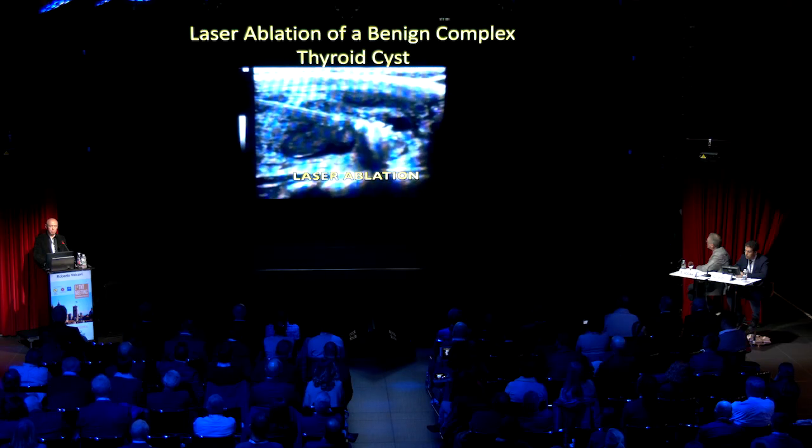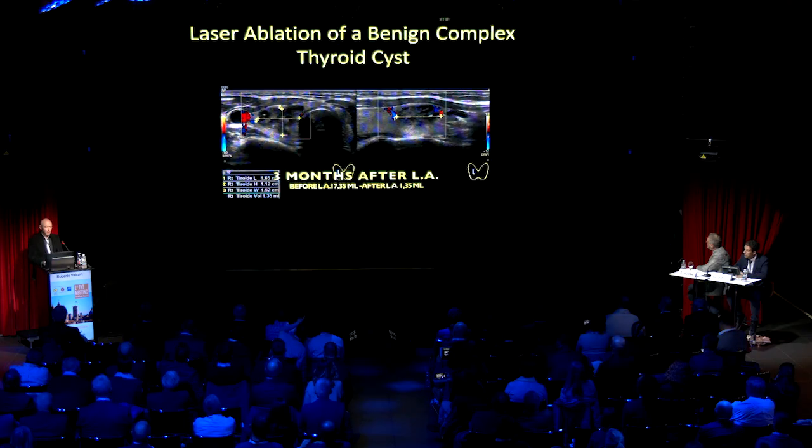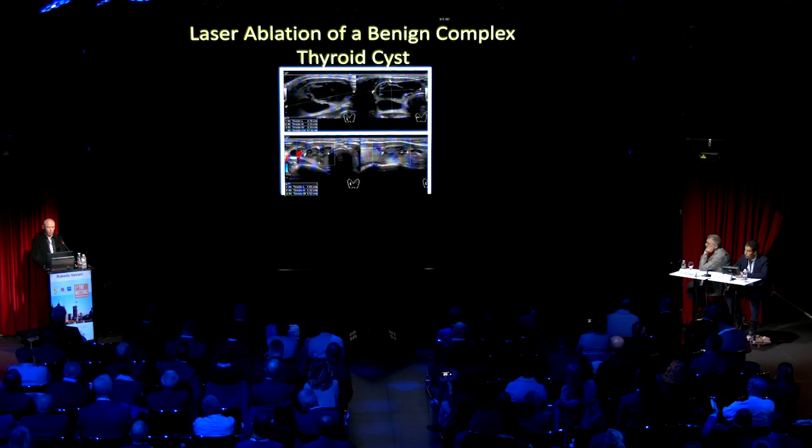This is laser firing. And these are the results only 3 months after laser ablation. We observed a clear reduction, the cyst was within the frame of the thyroid, and we had a 92.6% volume reduction rate with this treatment.